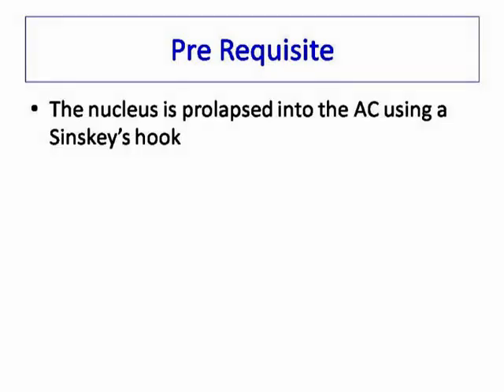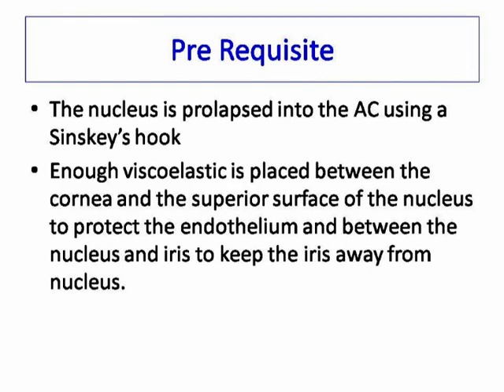The nucleus is prolapsed into the anterior chamber using a Sinskey's hook. Enough viscoelastic is placed between the cornea and the superior surface of the nucleus to protect the endothelium, and between the nucleus and iris to keep the iris away from the nucleus.